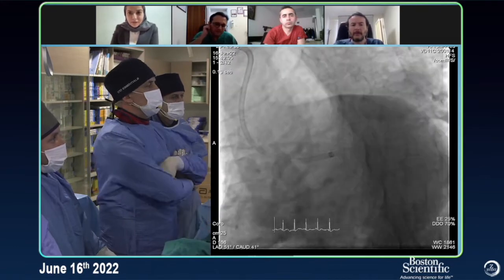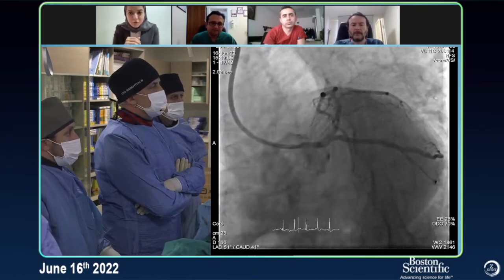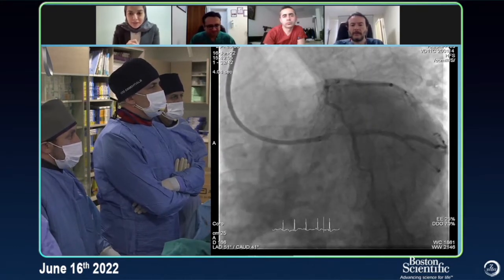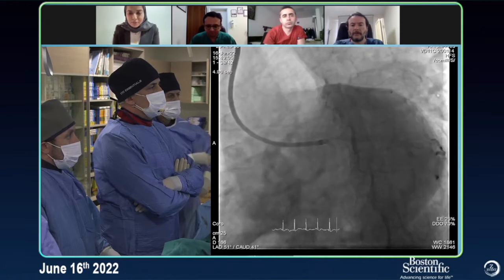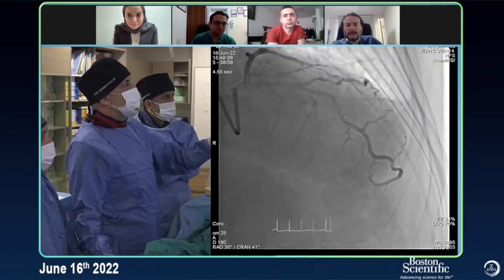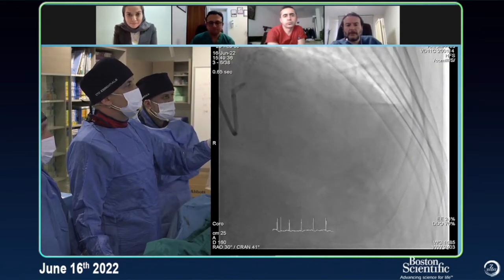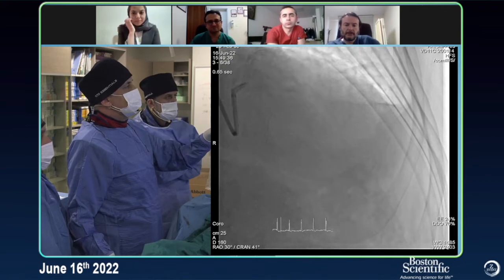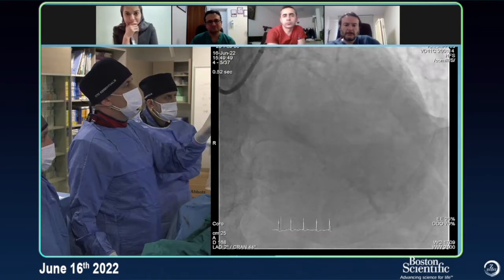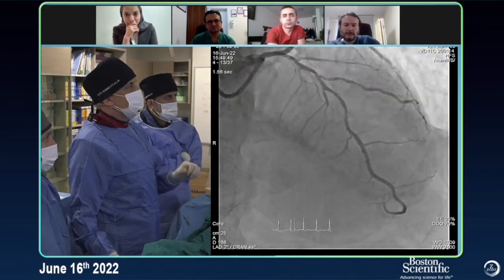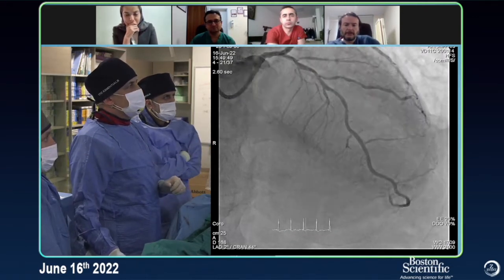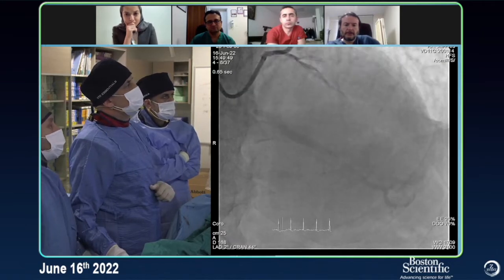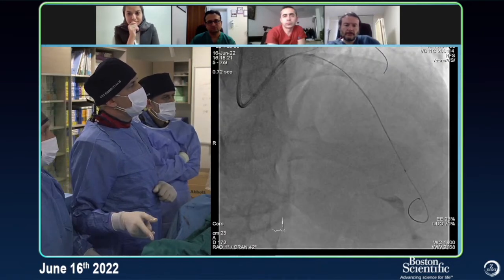Yeah, I agree. We'll go around before jumping into the case, just going through the panel. This is a long lesion, and it looks very heavily calcified. The lesion is eccentric, I would say.